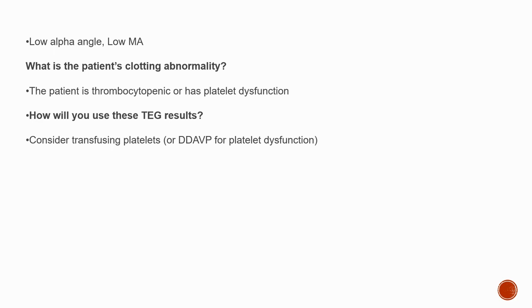Can we do any specific platelet function tests? Yeah, we can check by platelet aggregometry. By ristocetin and ADP, we can check for platelet function defect, where there are various platelet function defects like Bernard-Soulier, Glanzmann's thrombasthenia, and granule defect that we could differentiate by platelet aggregometry.